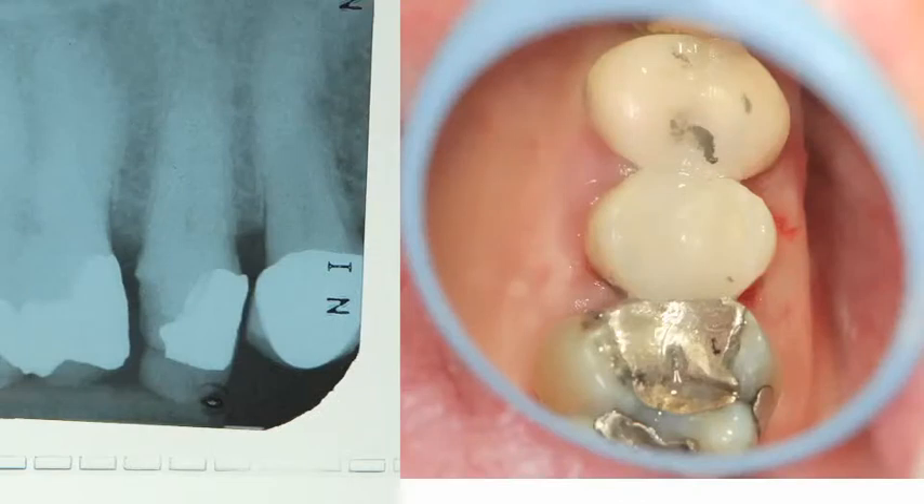Once in a while, the patient really needs a crown but cannot afford one. It's always worth a try to build up the tooth in composite and buy them some time until the financial situation changes. Here is an example of a financially strapped patient who decided to restore the bicuspid with composite, utilizing four ABC Wedges and a full matrix band.